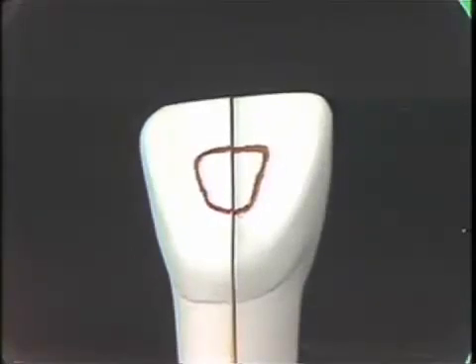The second step is once again to visualize the pulp, its position, its shape. Really get a picture in your mind of where you're going with the tooth. And don't start until you're pretty sure you have it. If it'll help you, you can outline on the tooth with a pencil what you expect your tentative outline form to be.